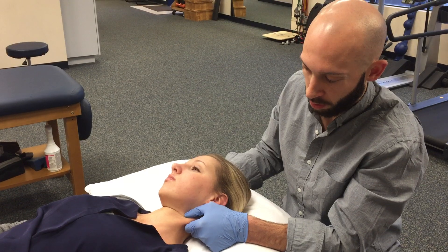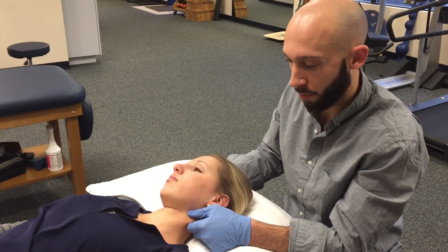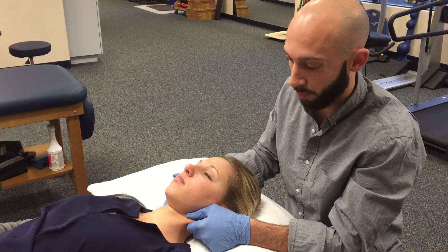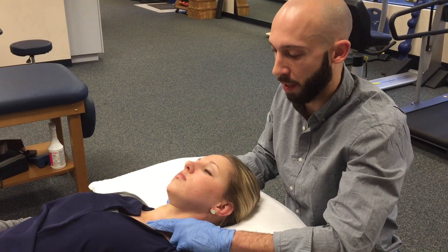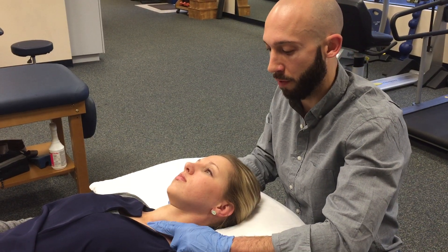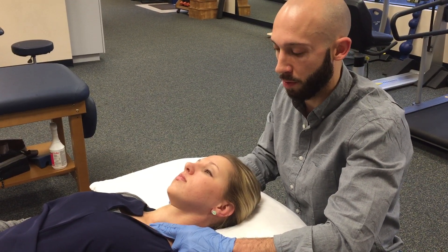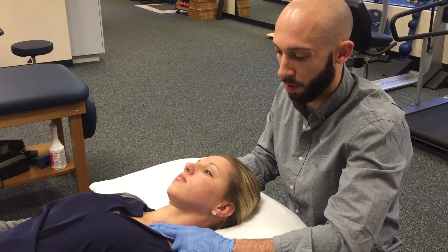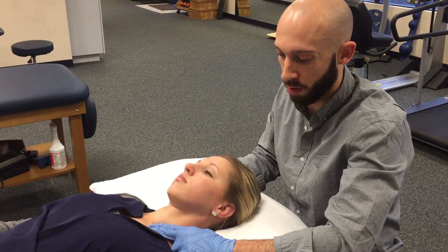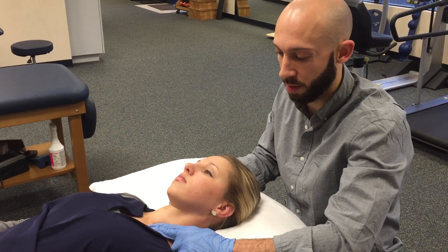Next we're going to look for our carotid artery, because when we needle we're going to avoid that. We'll come in here and palpate just above the clavicle — I feel a pulse there, so we know where the carotid artery is.